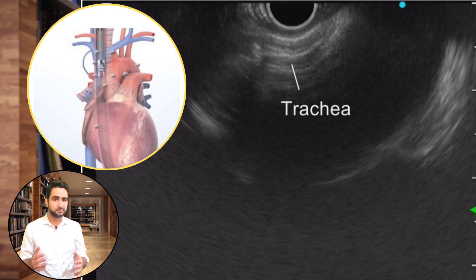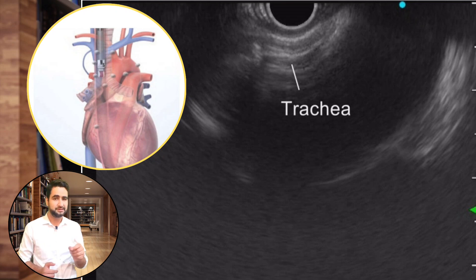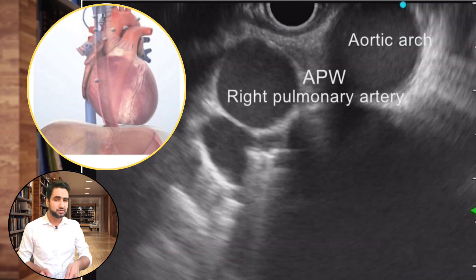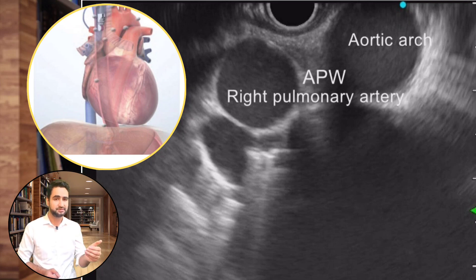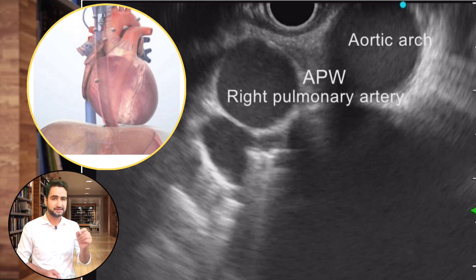As you pull the scope from the tracheal bifurcation, you will be able to identify the trachea visualized as multiple linear hyperechoic structures. Now withdraw the scope slowly to follow the trachea towards the superior side — that is the right side of the screen. While doing this, turn the scope counterclockwise till you reach a position where the right pulmonary artery is on the left side of the transducer and the aortic arch is on the right side. That's why you are now able to visualize the cross-section of the right pulmonary artery on the left side of the screen and the cross-section of the aortic arch on the right side. The region sandwiched between these two vessels is an area called the AP window.